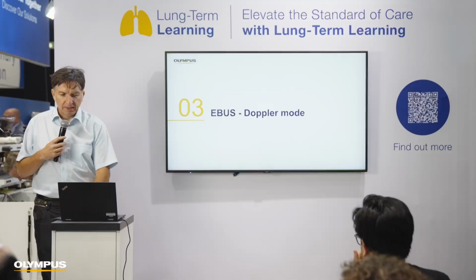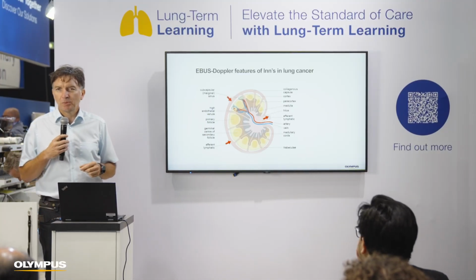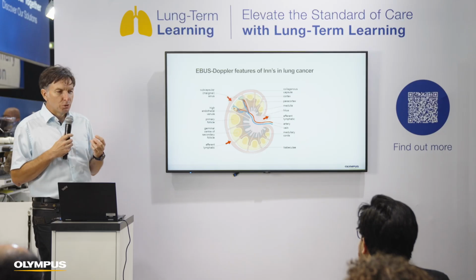So here are some additional numbers, but I won't lose time going through all these things. We also have some meta-analysis, which all show approximately the same, that B mode cannot replace cytology. What about Doppler mode? It's an additional and welcome feature. At the end, I'll show you a nice case where the Doppler can be very beneficial when you use it. But again, it cannot make a diagnosis.